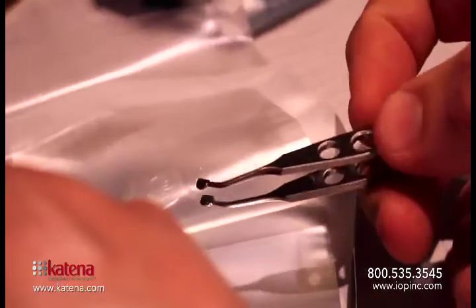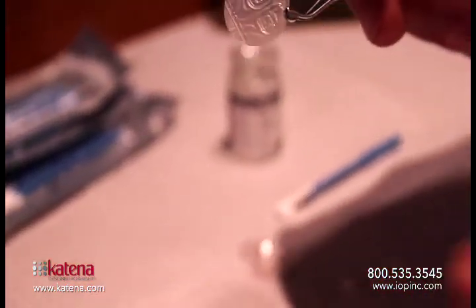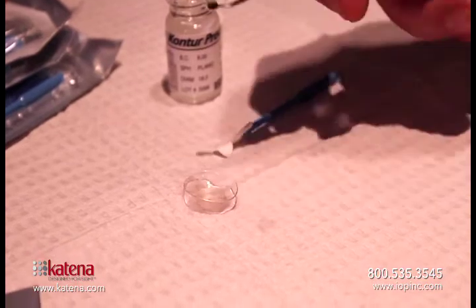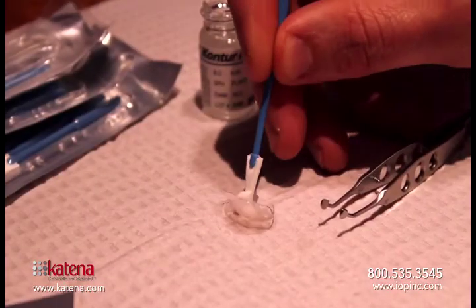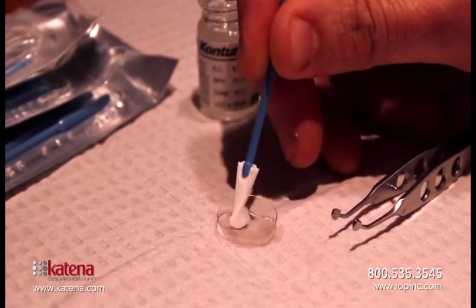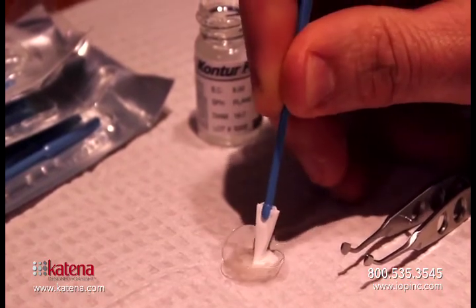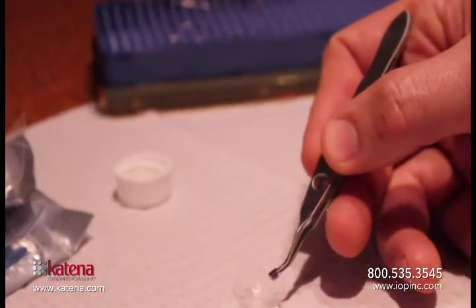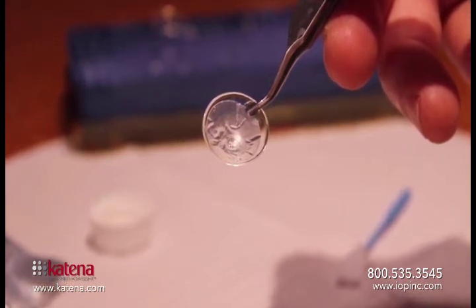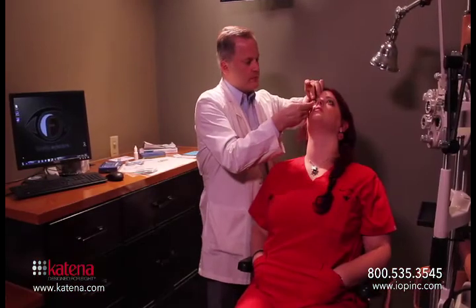Here we're picking up the AmbioDisc. You want to use non-toothed forceps and be careful not to damage the disc. You also want to take note of the orientation — you should see an IOP on the disc and you want to make sure that the IOP is oriented towards the cornea. Try to place the AmbioDisc in the center of the dried contact lens. It's going to adhere very quickly so try to get your placement right to begin with. You can then take a Wex cell and smooth out the AmbioDisc across the back surface of the contact lens, getting it nice and even and centered. Here we can see the AmbioDisc properly oriented on the back surface of the contact lens with the IOP facing the surface of the cornea when it's placed on the eye.